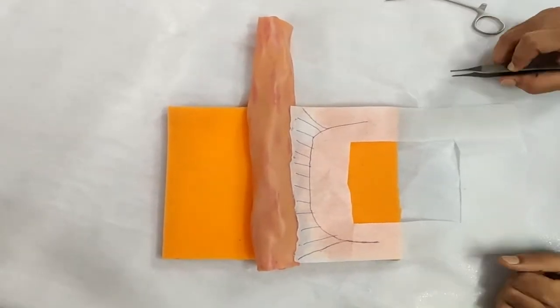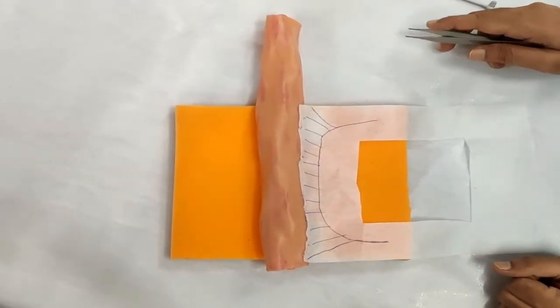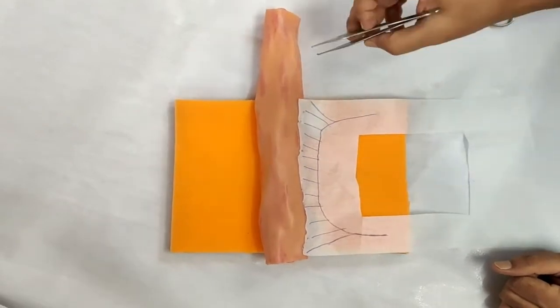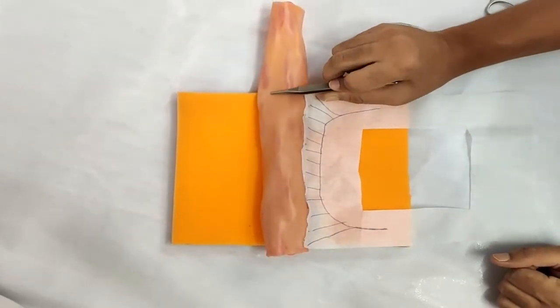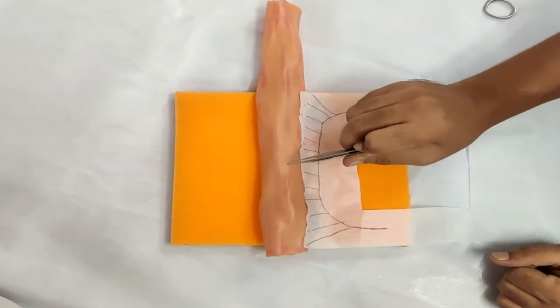So coming on to intestinal resection and anastomosis. There are certain things we need to keep in mind. Here is a loop of small bowel which apparently is diseased and we need to resect and anastomose.